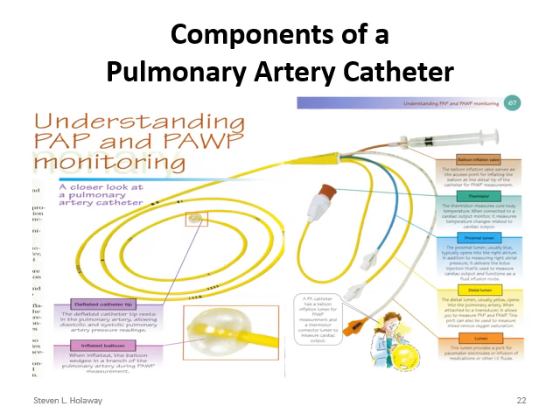So this gives you a little bit better look at it. You can look through this. Basically, when the catheter is sitting in the heart, the balloon is down. We only blow the balloon up if we want to measure a wedge pressure.